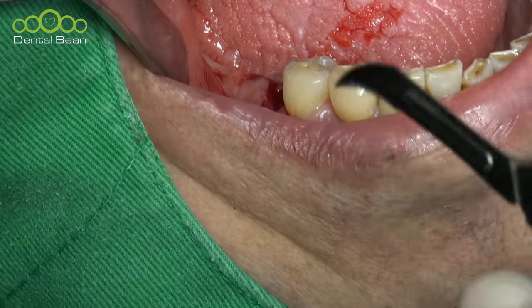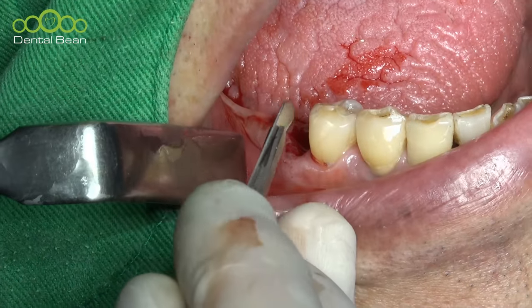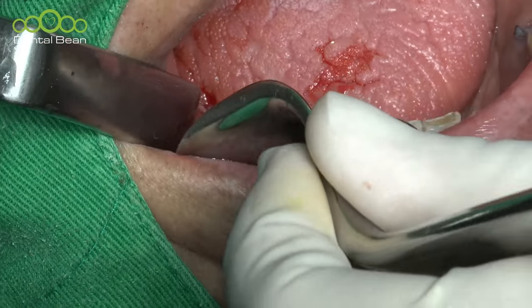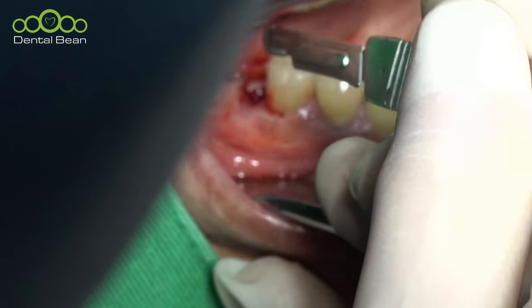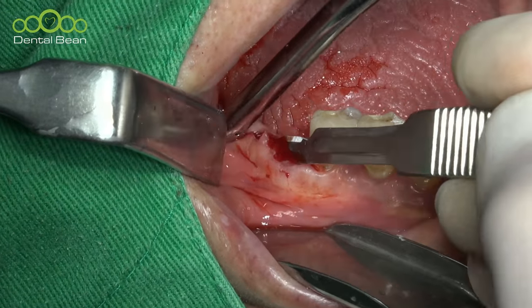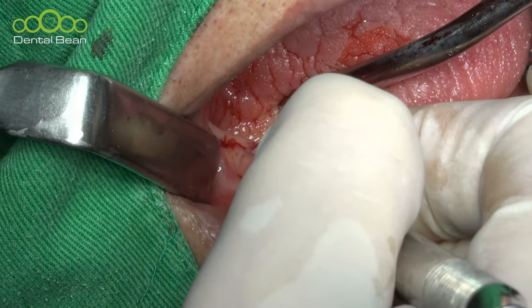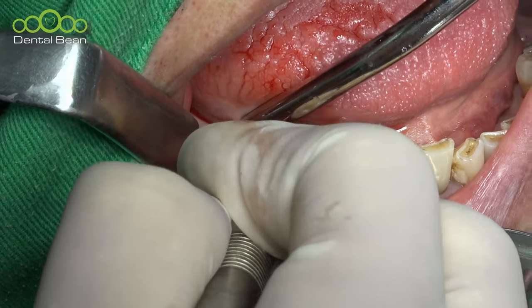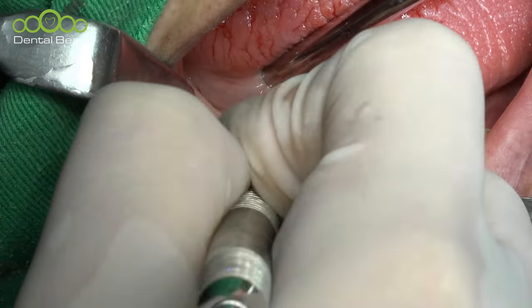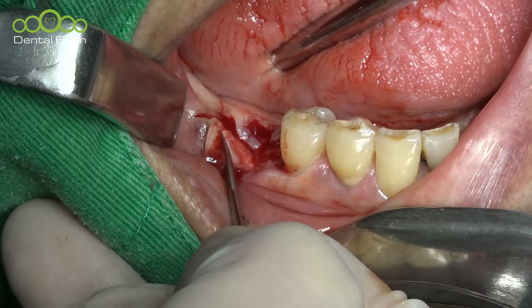Okay, the Langenbeck. Actually, in the lower right side, the broadcasting is very difficult sometimes. Same. The distal end area. Y incision here. This small kind of maybe 2 millimeter Y incision is very helpful for the flap elevation without vertical incision.